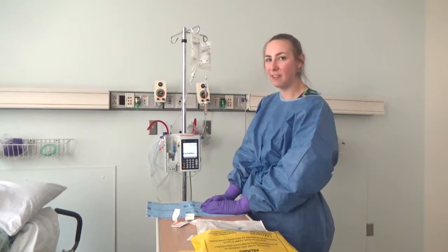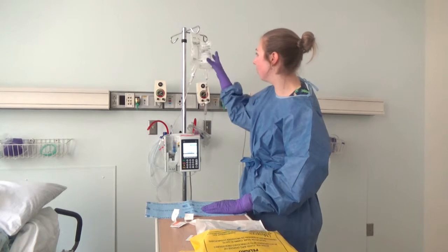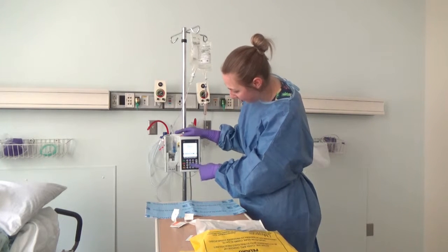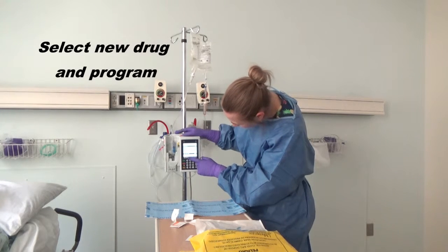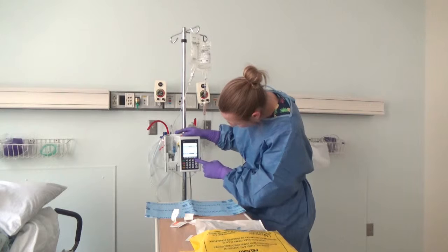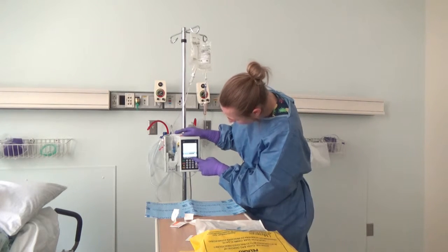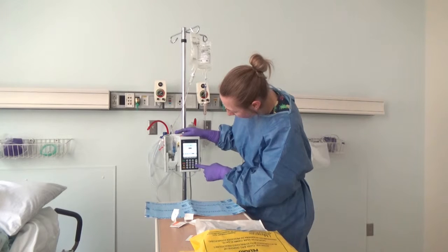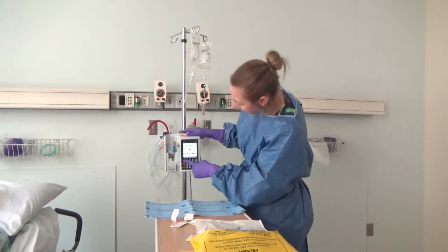Now that we've completed our flush to prime the bag and pump, we're going to go ahead and set up the rate for our chemotherapy. We'll go to the B line, clear our settings from our priming, go to our drug library, select our next drug, which in this case is etoposide, and then enter in, according to orders, your rate and volume. Go ahead and hit start.